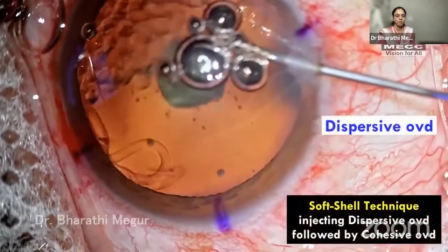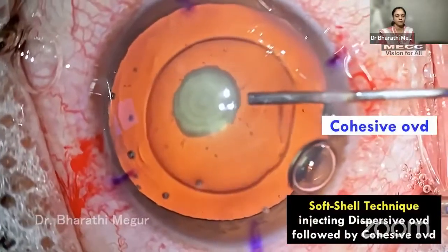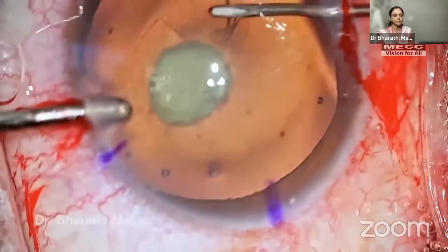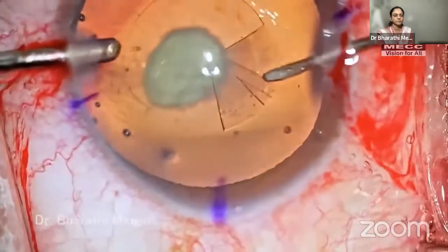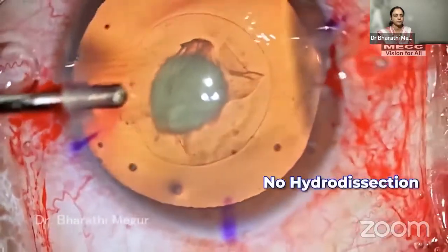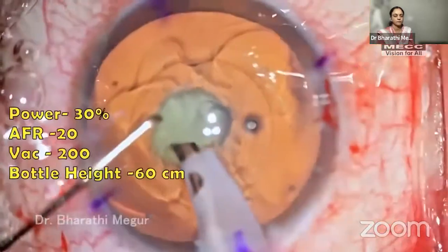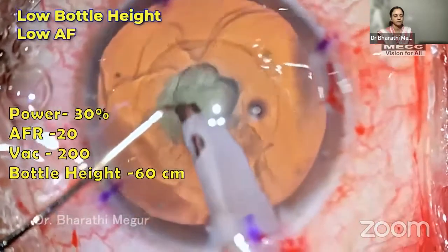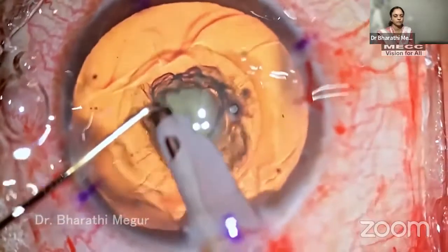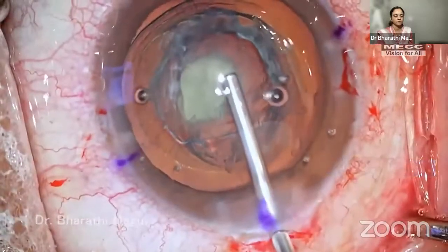I inject dispersive OVD followed by cohesive OVD. I am careful not to pressurize the anterior chamber. I am aiming for a 5 mm central capsulorhexis. Sizing and centration of the rhexis is quite critical in post-polar cataracts, as we might need the anterior capsular support to capture the optic in the event of a PC tear. I am using low bottle height, low flow rate, low vacuum and power. The superficial cortex and epinucleus are removed with low parameters.